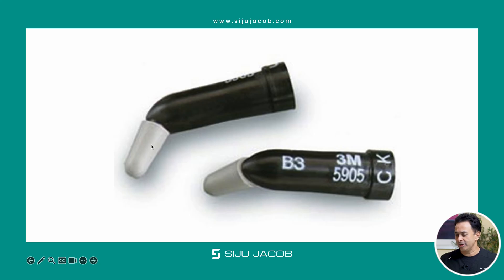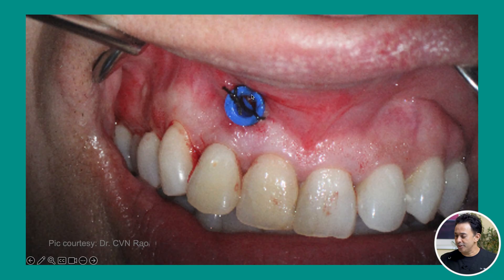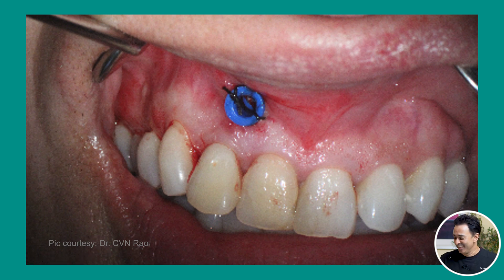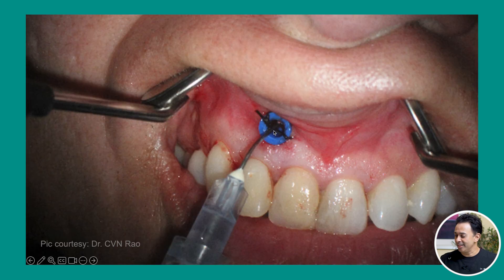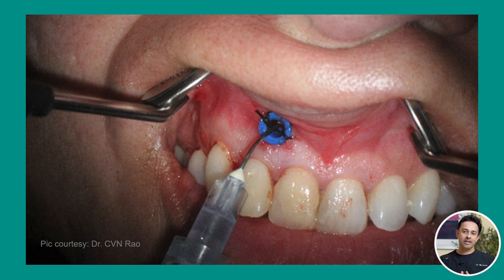Another material option that my friend Venkid likes to use is composite compule caps. You remove the cover, cut the tip portion off, and use the remaining portion as a drain, cutting it down to the required size. Here you can see Venkid has used this — a composite compule sutured to the adjacent tissues after sterilization. Then you can use an irrigation needle to drain out the contents of the cystic cavity, and you can teach the patient to do this at home.